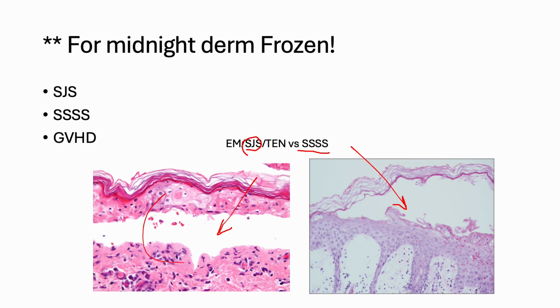And as we mentioned, the histology of the SJS, I'm not going to repeat here. But for the 4S, the histologic change is the separation should be below the stratum corneum and above the keratinocytes, because there is antigen targeting this area. And there should not be a lot of this dyskeratosis. So I hope you can make the diagnosis if the differential is SJS from the 4S.